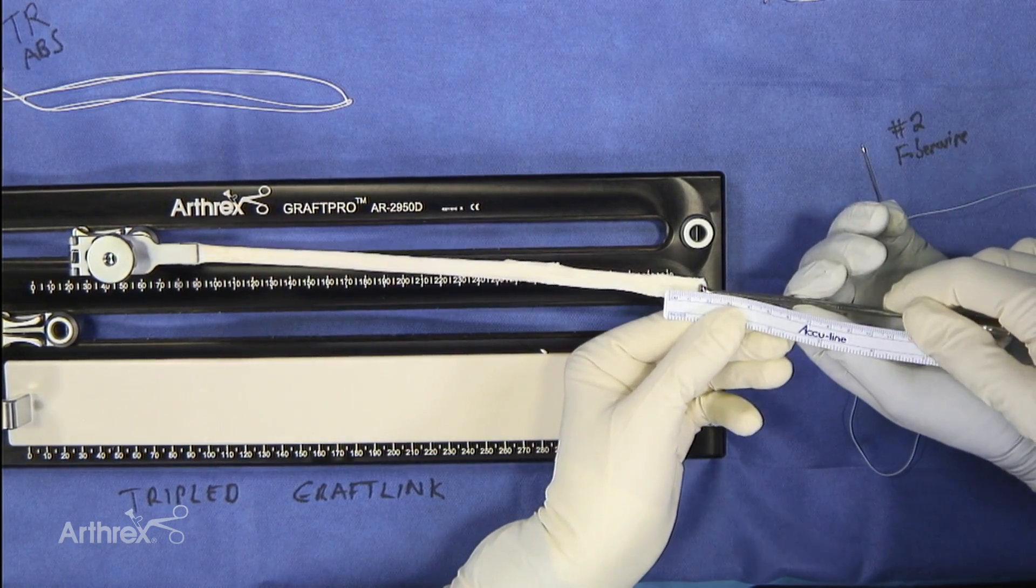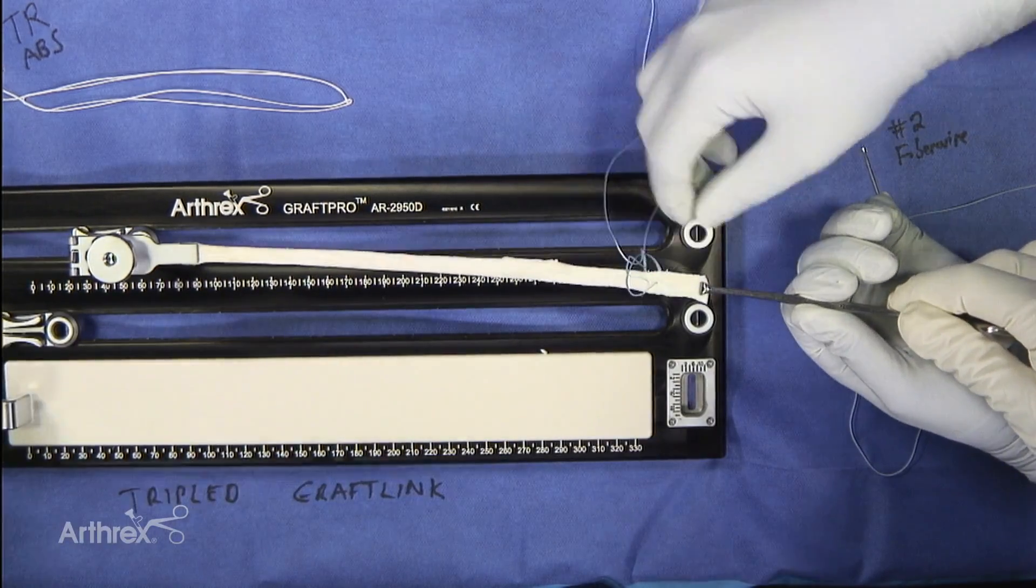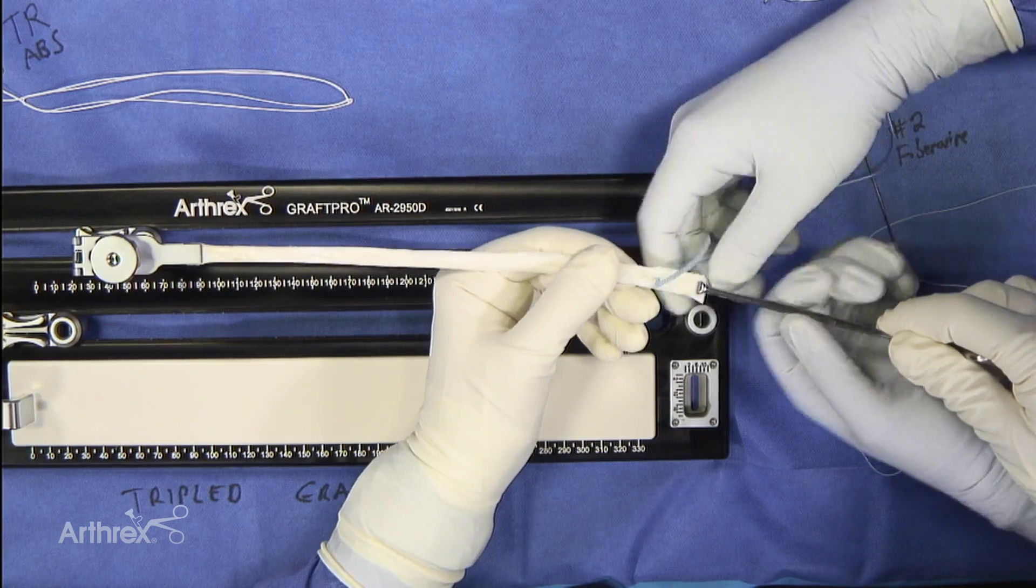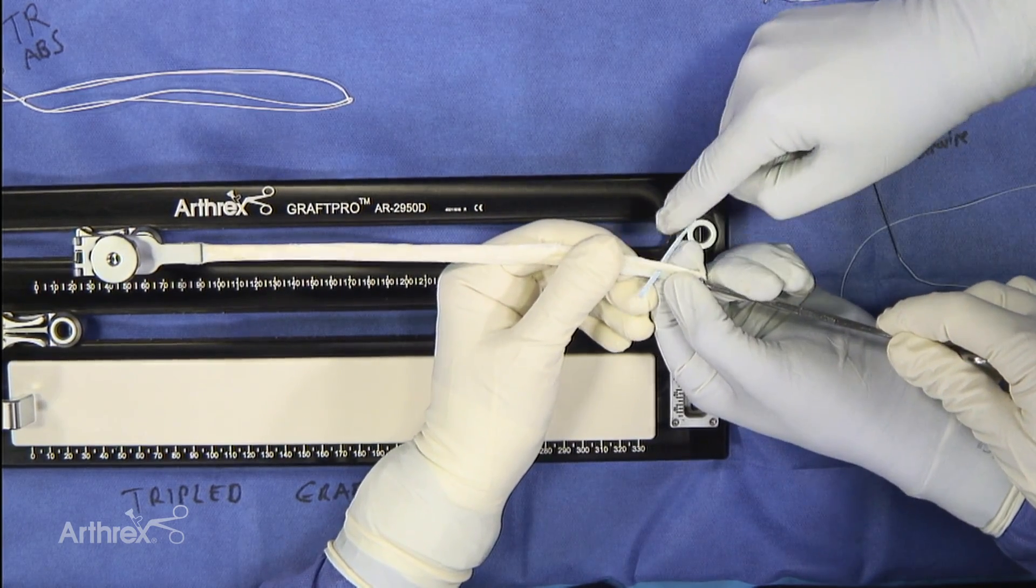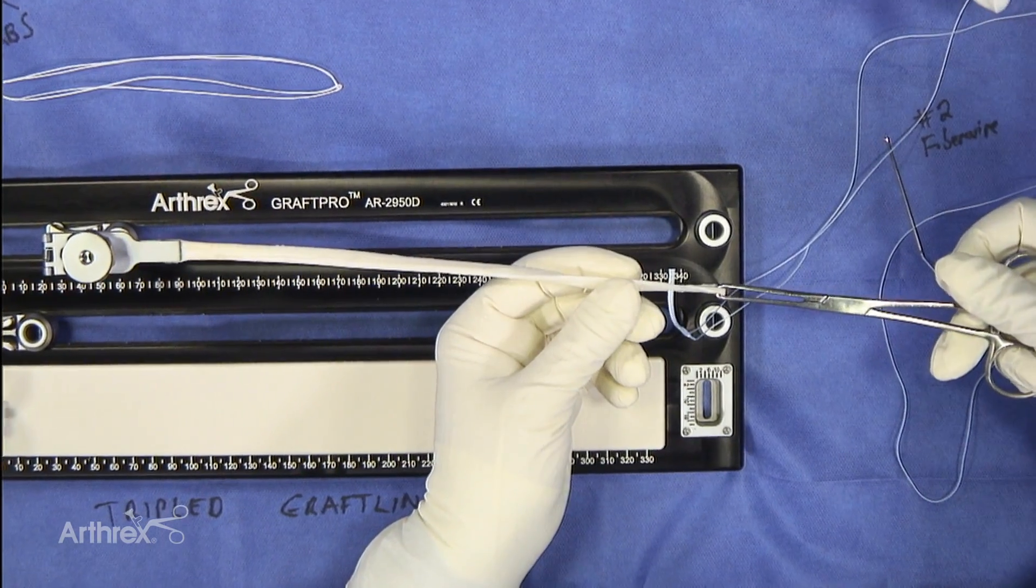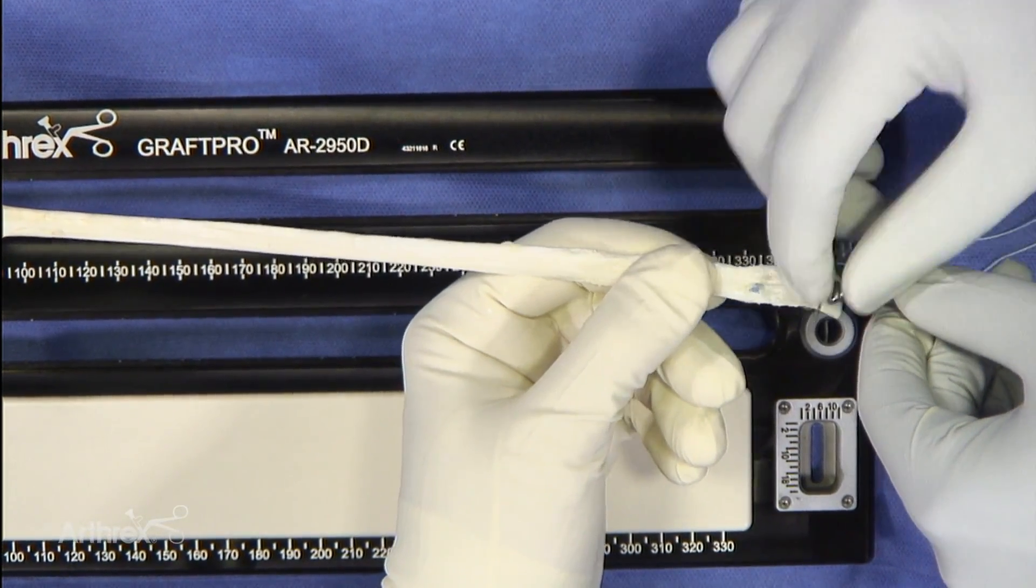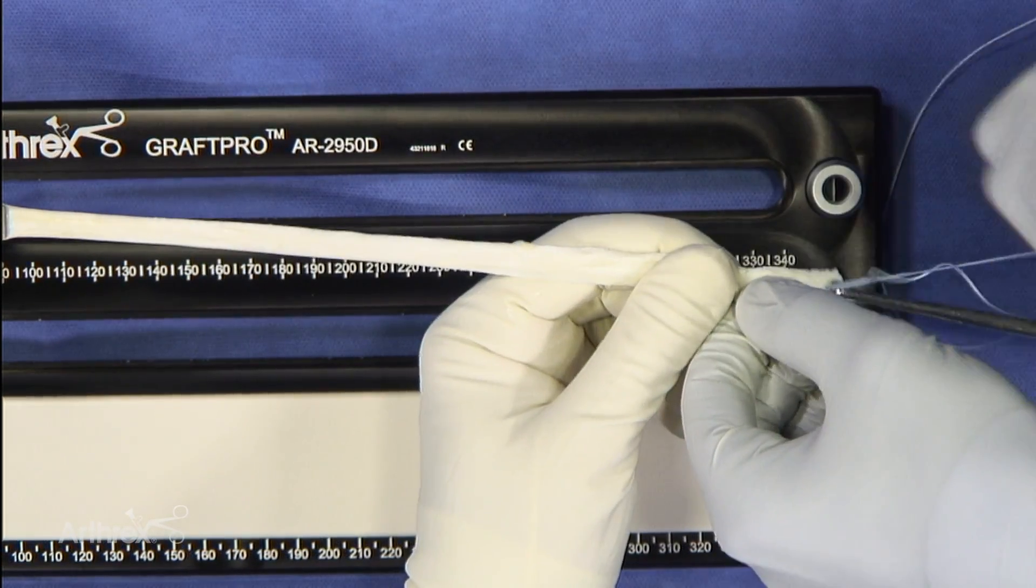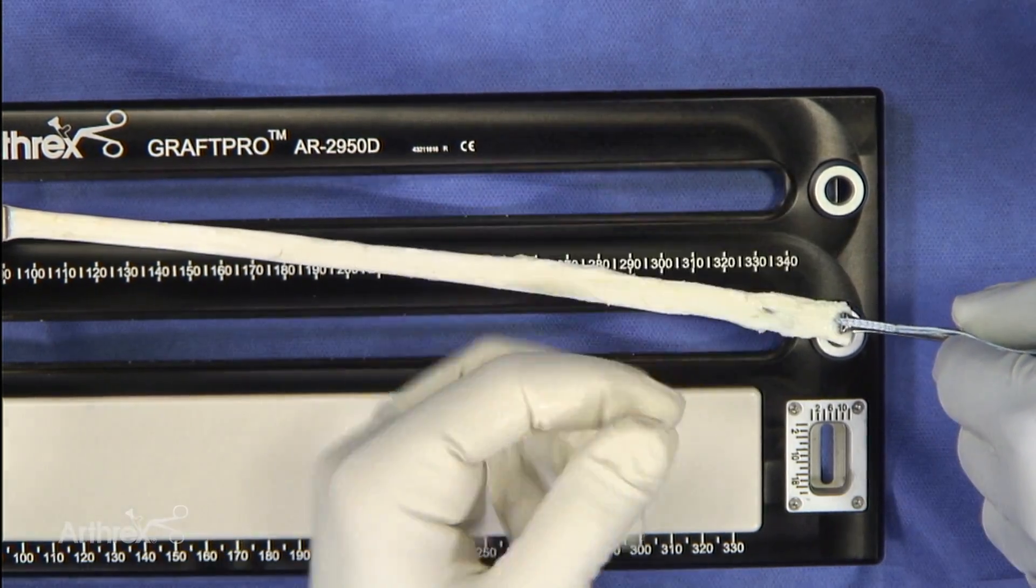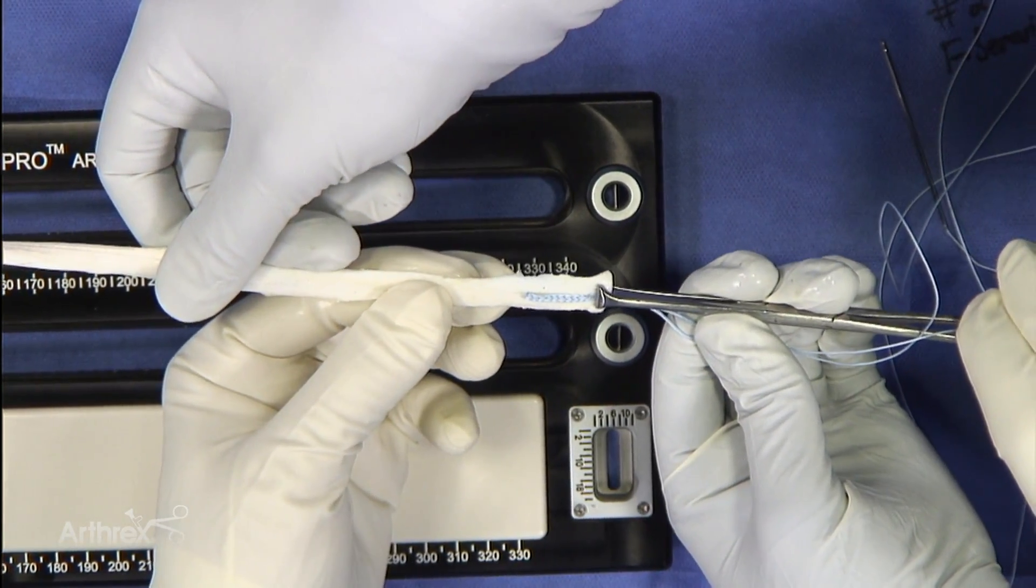So the first thing we do, we're going to come right up about 25 to 30 millimeters. We're going to pass the fiber tag through. You don't want to pull too hard, just get it so that it just pops right at that spot, so that you don't pull it all the way through. You can see you leave just a small tail. Now we're going to come underneath, and you want to make sure that you keep this tail. And there you can see the fiber tag in place.